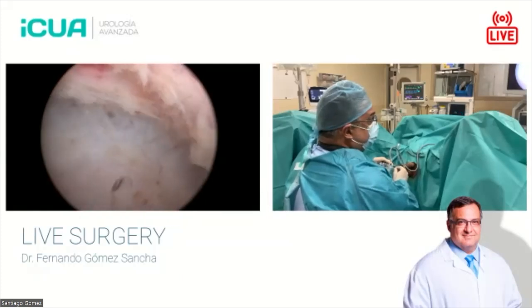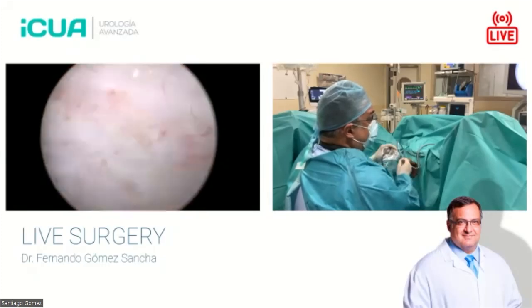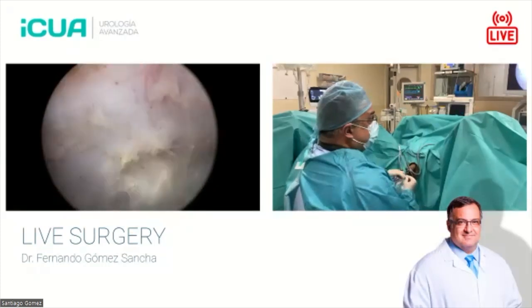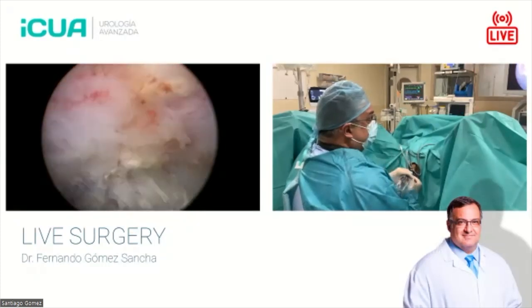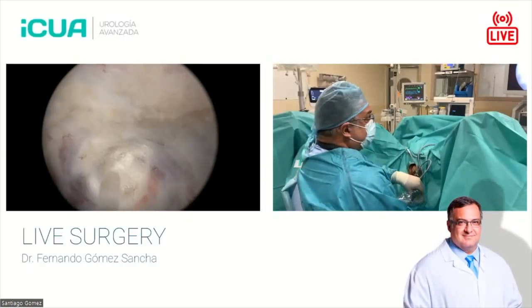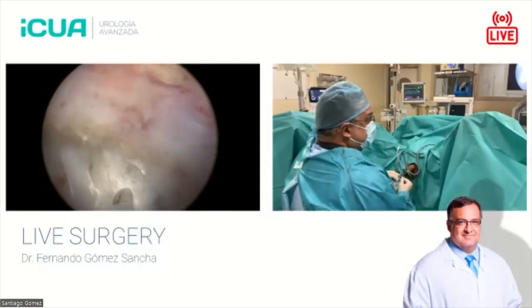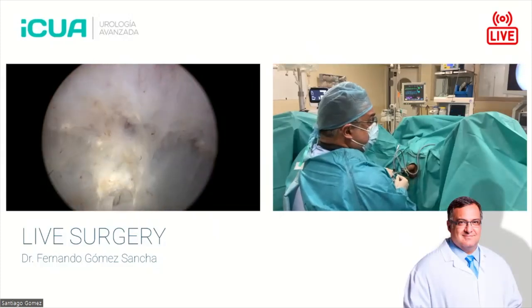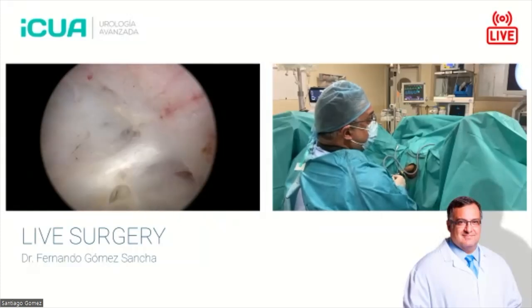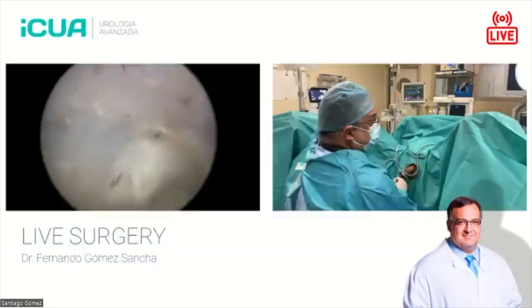If I fire far from the tissue, nothing happens. If I fire too close, I will make a hole, you see? If I choose the right distance, I will get some dissection effect that is soft and nice. And Fernando, you still have the settings 2 joules, 50 hertz? Yes, these are my lifetime settings. But I think the settings are not the only determinants. Distance, as I said, is factor number two.